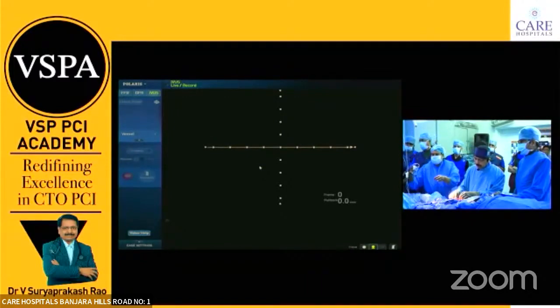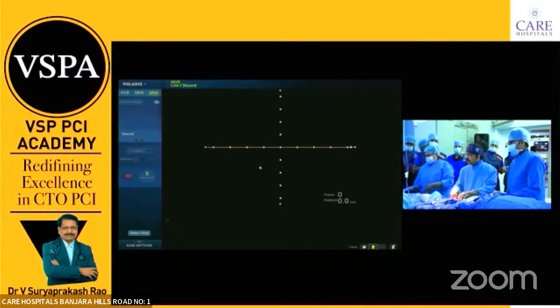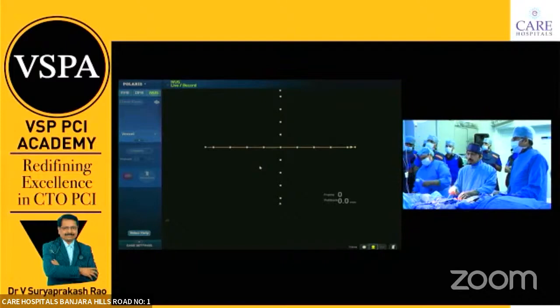Now the thing is, the distal size beyond the CTO is 2, and at the site of the CTO, what is the size, and proximally how much? While the guide holds, I'm pulling back.